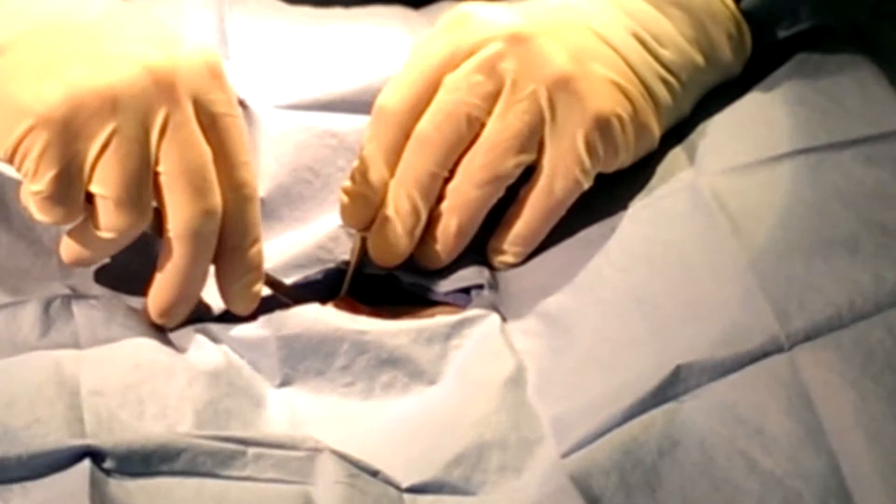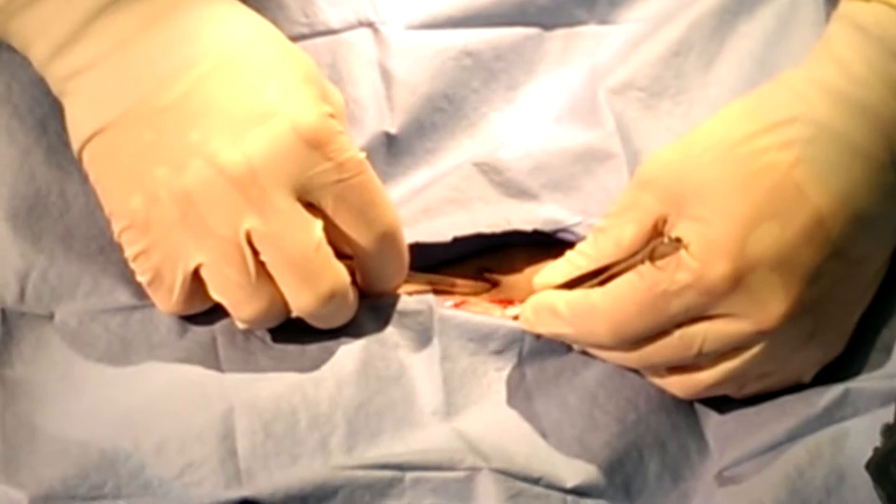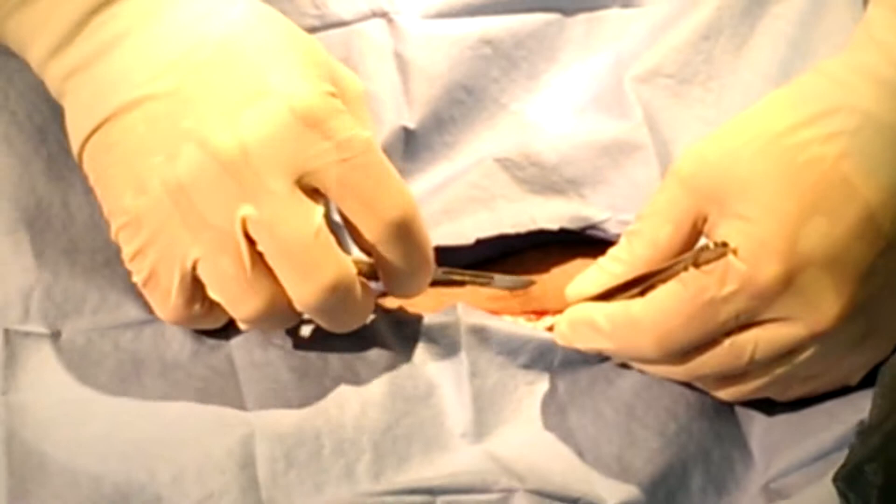Most veterinarians will not have a scrub person to hand them any of this stuff — it takes a lot of thinking for him to ask you for this kind of stuff. Right now, if you look, this is the subcutaneous tissue. If I slide it back and forth, I can make out the linea underneath — it's actually riding right underneath my scalpel right there.